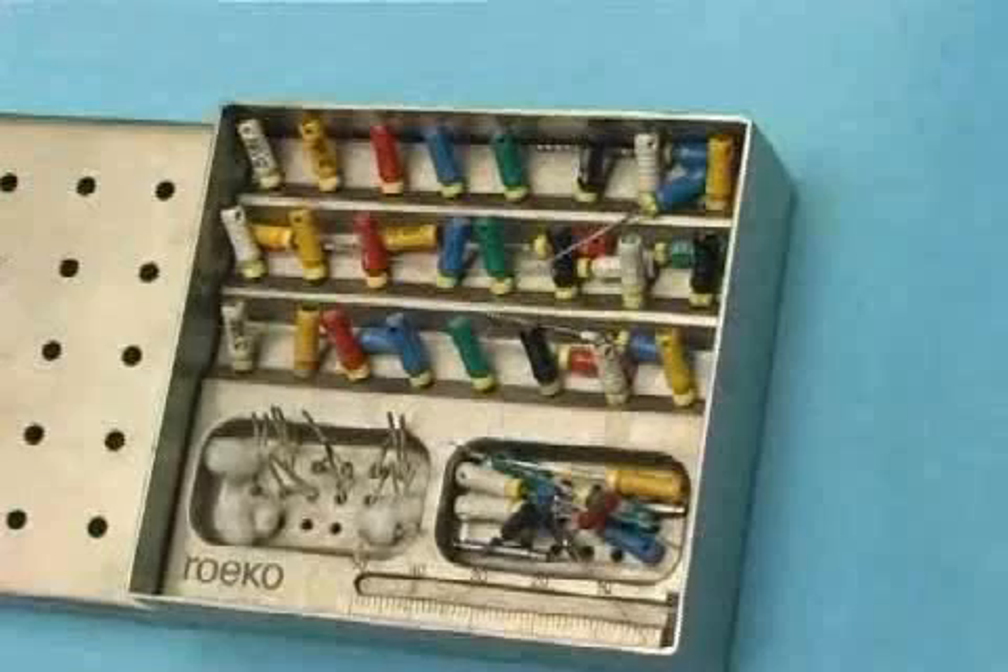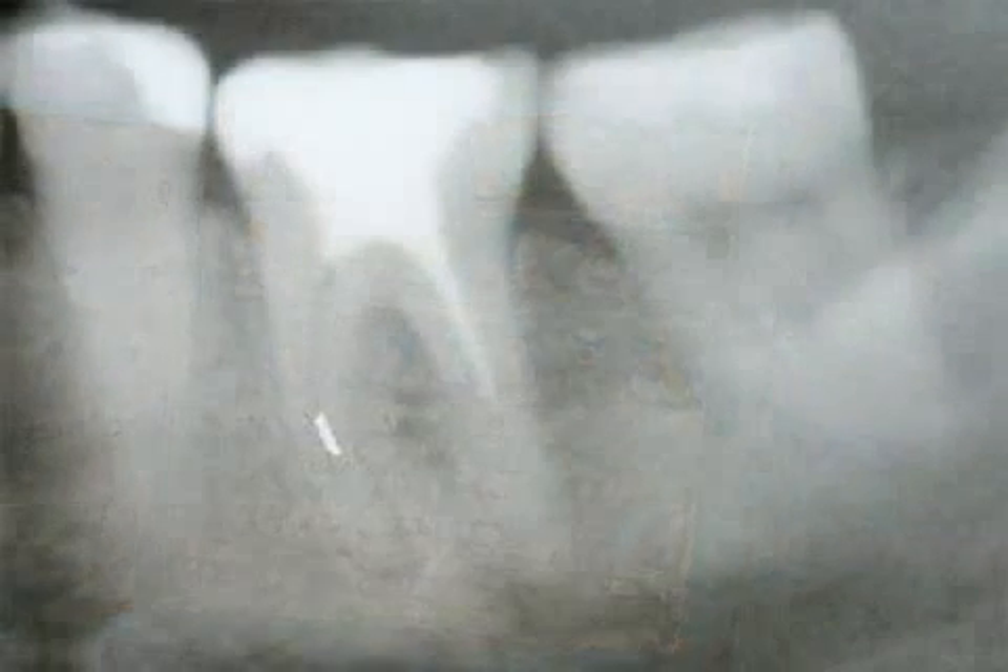Unfortunately, the instruments are very strained by the sterilizing process. This is why they should be exchanged every few procedures. Old instruments can break far more easily.